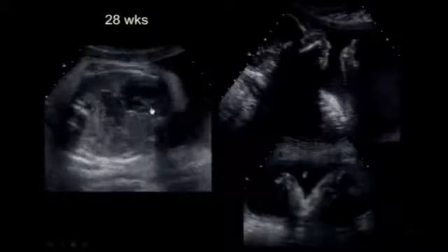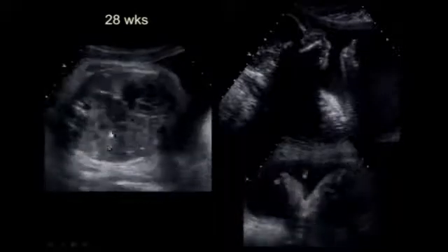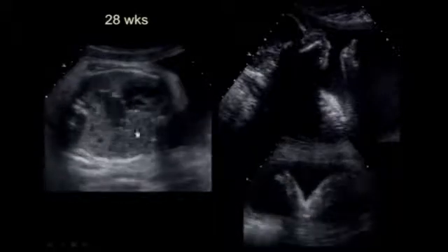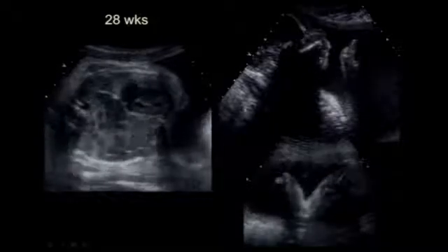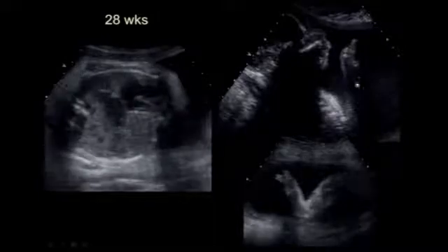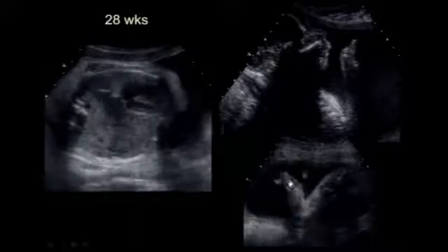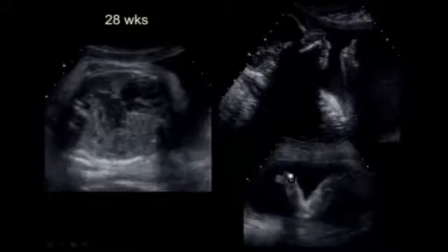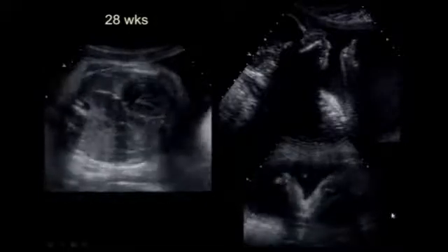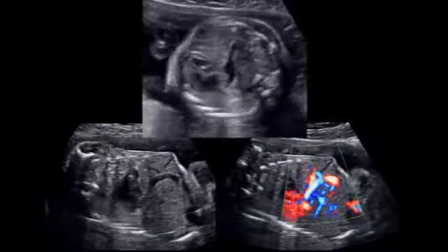Here's a fetus seen at 28 weeks. Again, the heart pushed way over to the right side. A big hernia. This one had large bowel and small bowel. And when we look at the profile view, you can see micrognathia, and the hand, which was up in front of the face, looking somewhat abnormal on the static, but clearly abnormal on the video clip. There were only 2 fingers on this hand. So be sure to look for associated abnormalities.